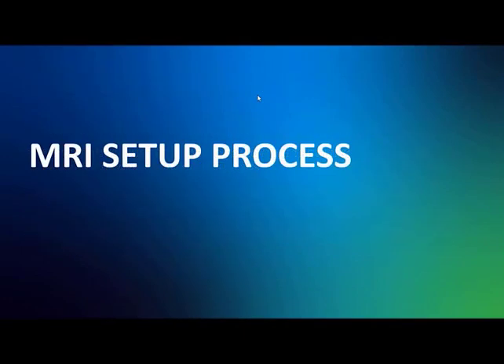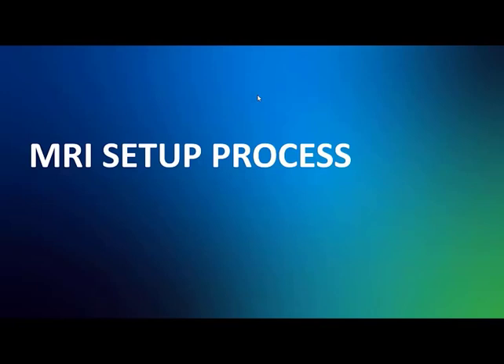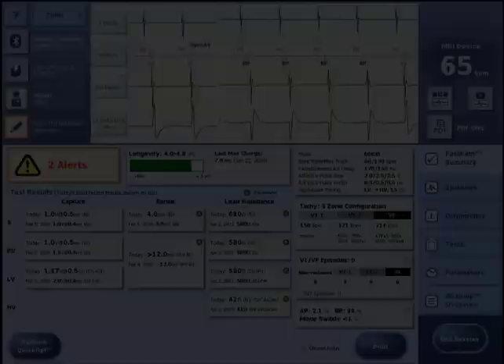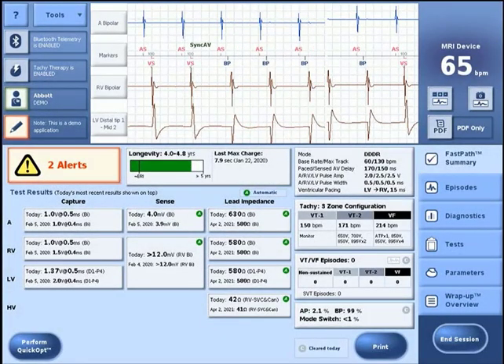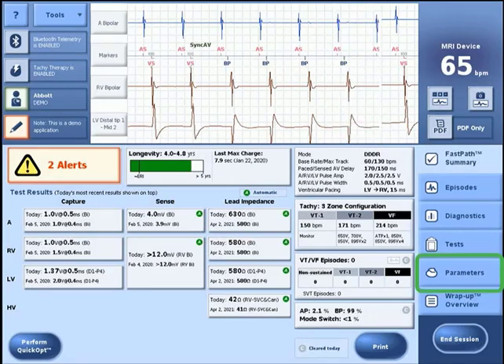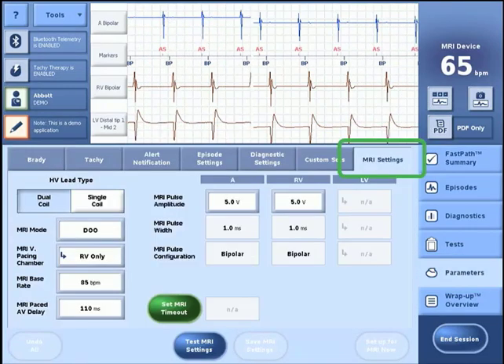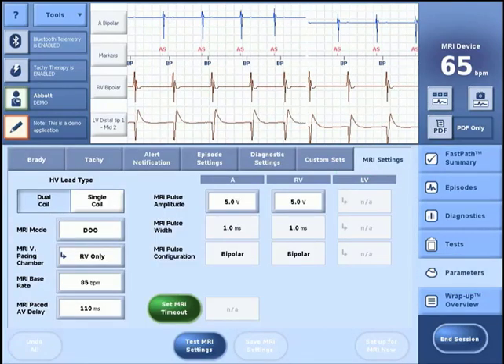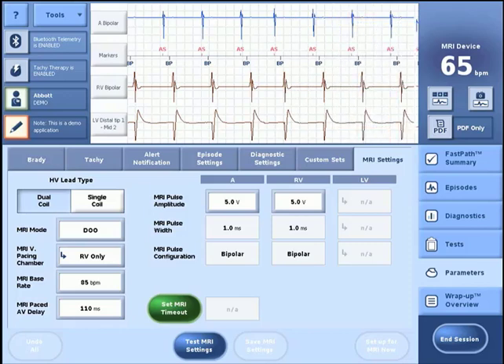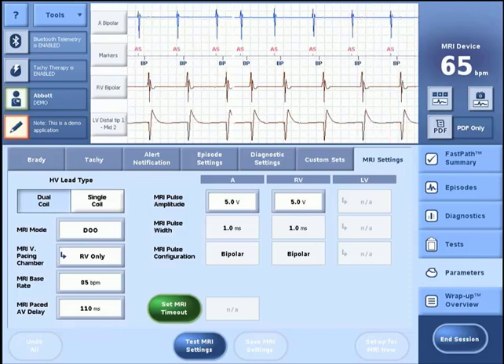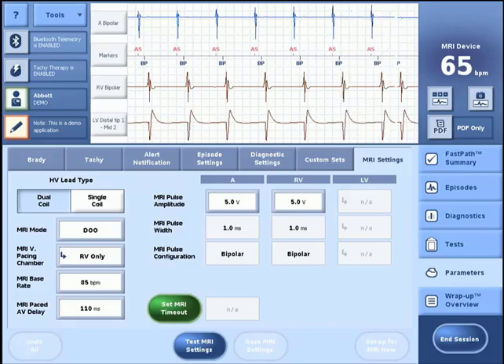To set up the device for MRI and enable MRI settings on a next-generation high-voltage MR conditional system, following the initial interrogation of the device, select the Parameters menu and then select the MRI Settings tab. There are multiple steps in the MRI programming workflow before the device is in the MRI settings active state and thus ready to undergo an MRI scan.